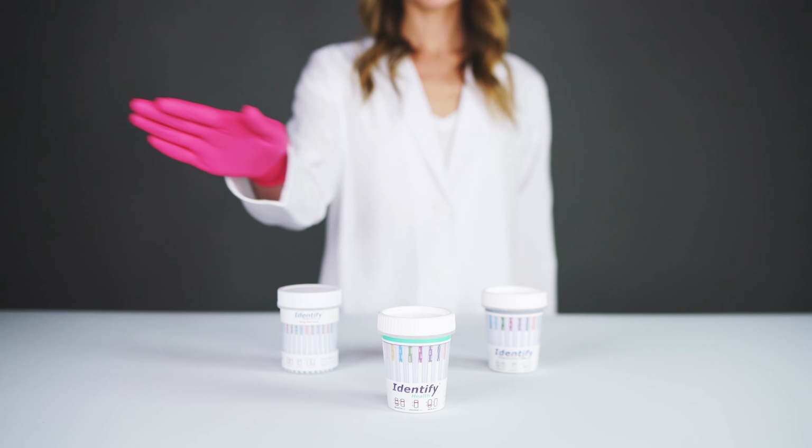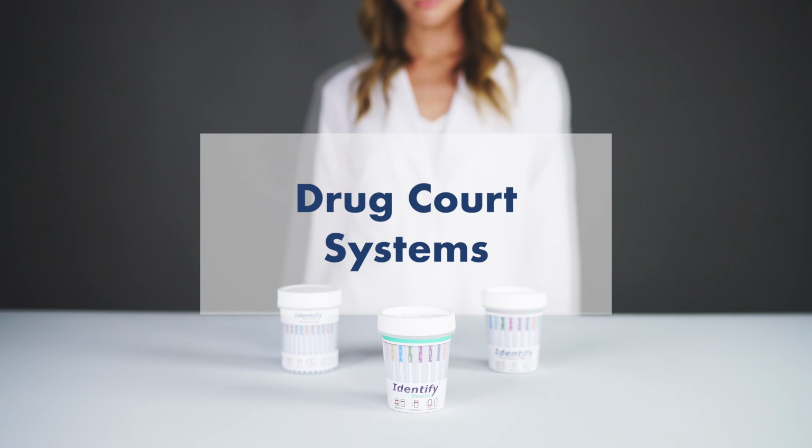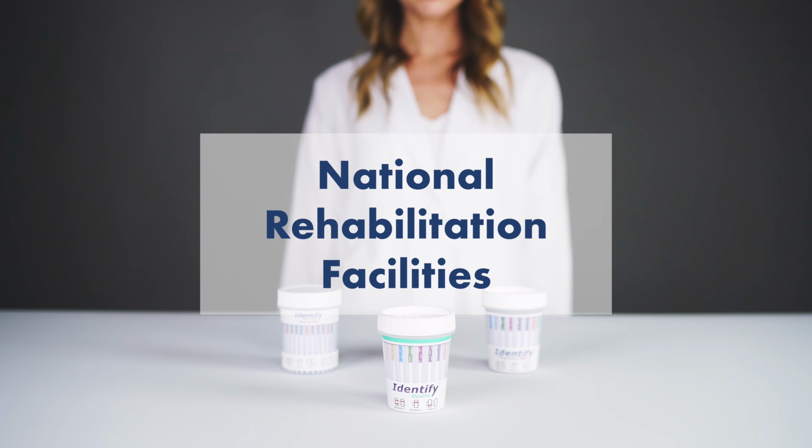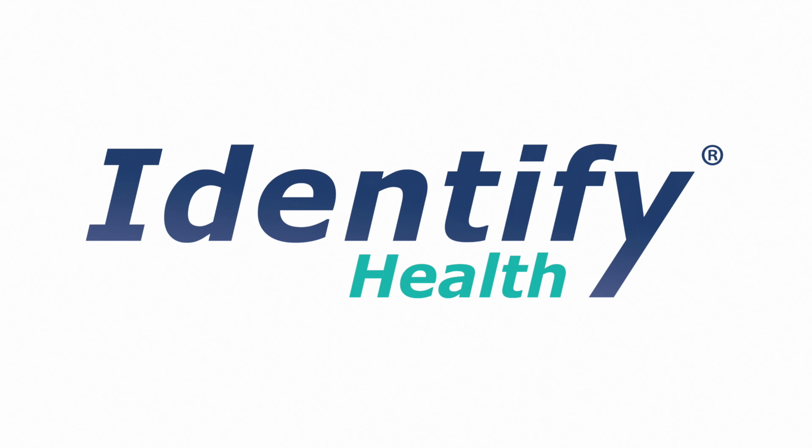Identify point-of-care devices are utilized by hospitals, pain management physicians, drug court systems, national rehabilitation facilities, employers, and small home offices. Let's get started with the manufacturer's step-by-step instructions on how to perform and interpret your Identify drug test device.